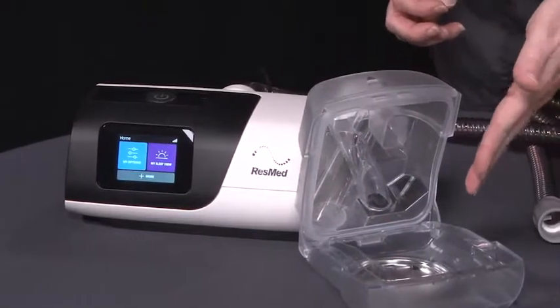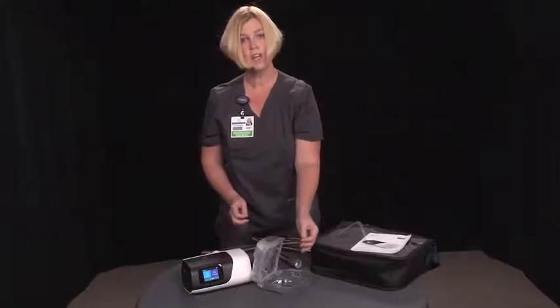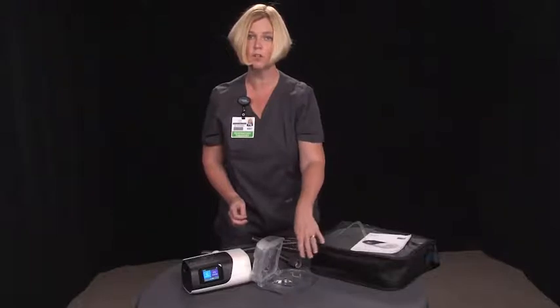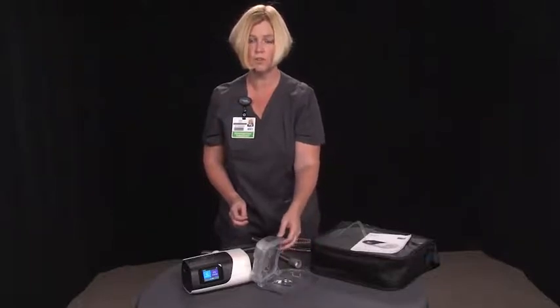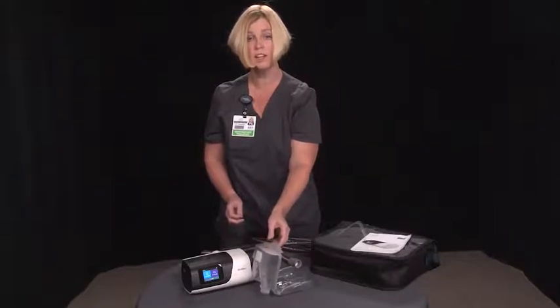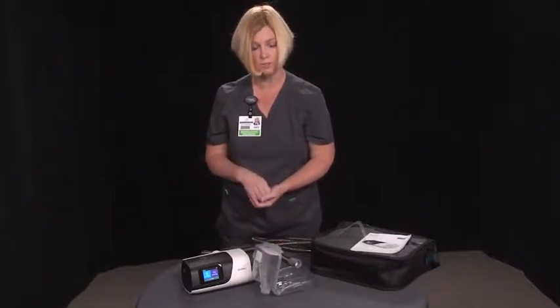Inside is where you're going to pour your distilled water. You do not want to use tap water, as tap water can attract bacteria and cause a film to develop on the bottom of your water chamber. Distilled water can be purchased at any drugstore or grocery store, usually in a gallon-sized jug.